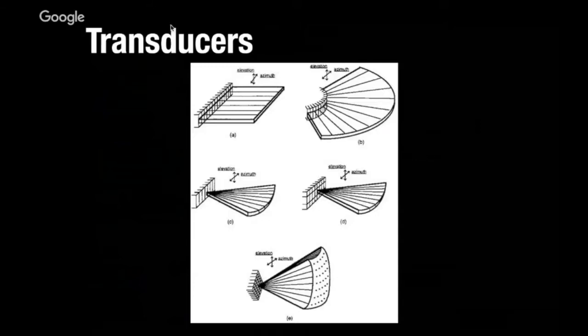It used to be that the innovation was we'd create this one probe where instead of one face, we'd put a whole bunch at angles to each other, at phased angles to each other. So you have an array of faces at phased angles, and we call that the phased array. Every probe now is a phased array.